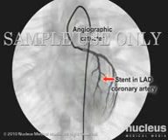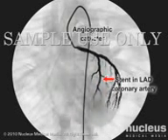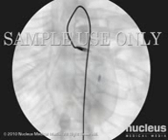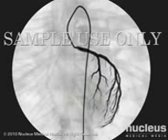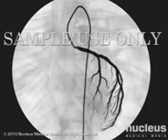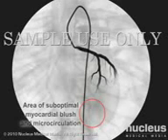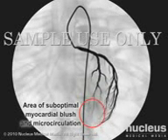after revascularization. This simulated fluoroscopic examination demonstrates the limited flow of blood to the damaged heart muscle. The injected dye should flow freely from the main vessel to the arterioles and capillary bed, commonly referred to as myocardial blush. In this case, however, the contrast dye fails to reach the ischemic tissue, indicating what is commonly referred to as suboptimal myocardial blush and microcirculation.